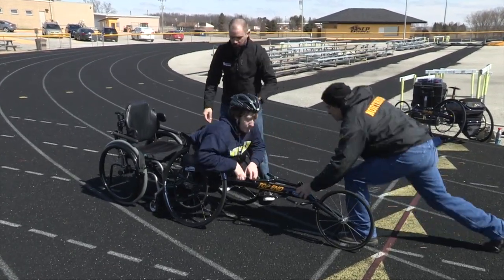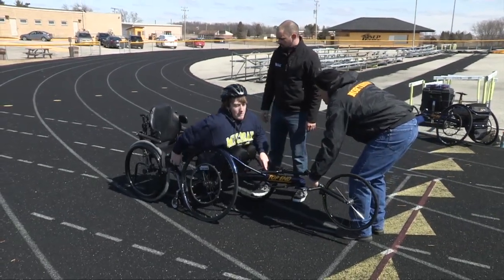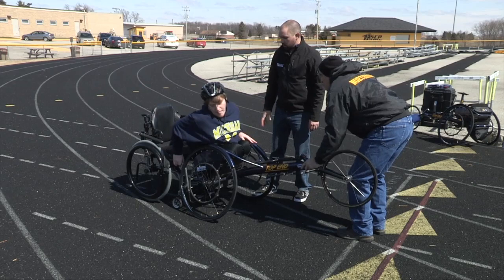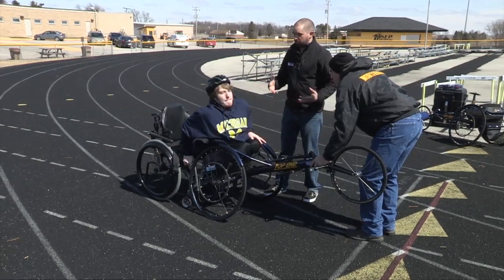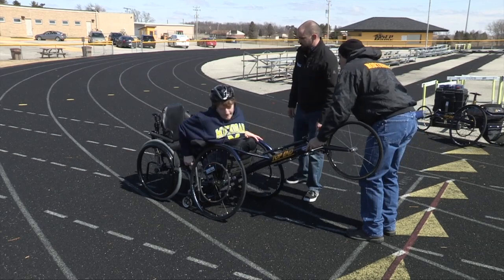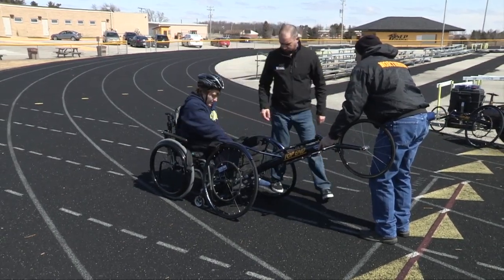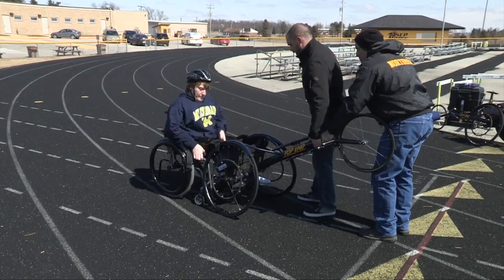Let's go ahead and lift him up a little bit. Your athlete should be able to communicate how he's able to do this. Get your feet out, let's move up a little bit more.